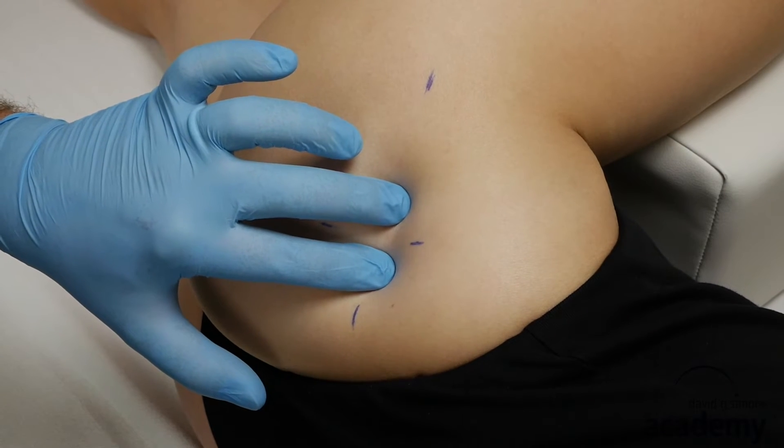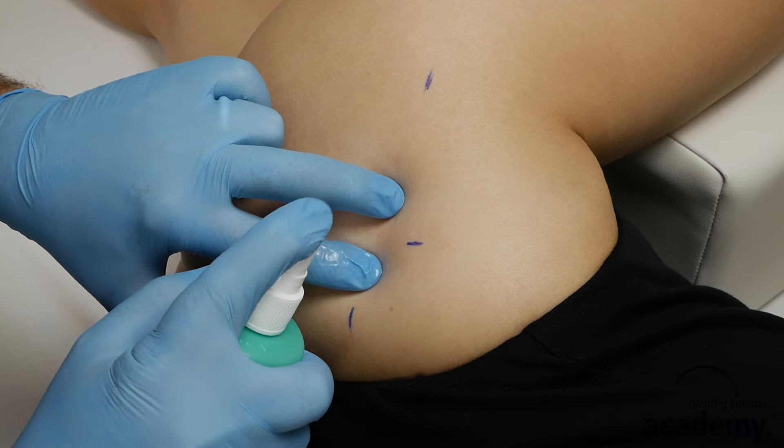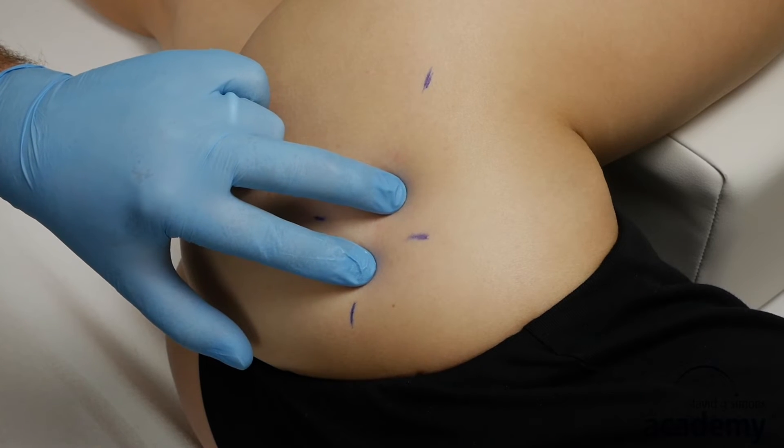Disinfect the skin where you will insert the needles. Then place the first needle into the trigger point.